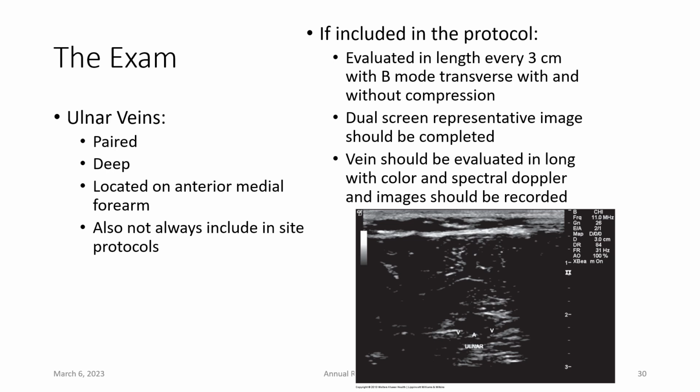If you are ever uncertain, if you can't get them to fill maybe with your color, a slight augmentation can help fill both these and your radial veins. You can also check for augmentation to see that the vein is clear between where you're scanning and where you're augmenting. Those things can be very helpful in this region.